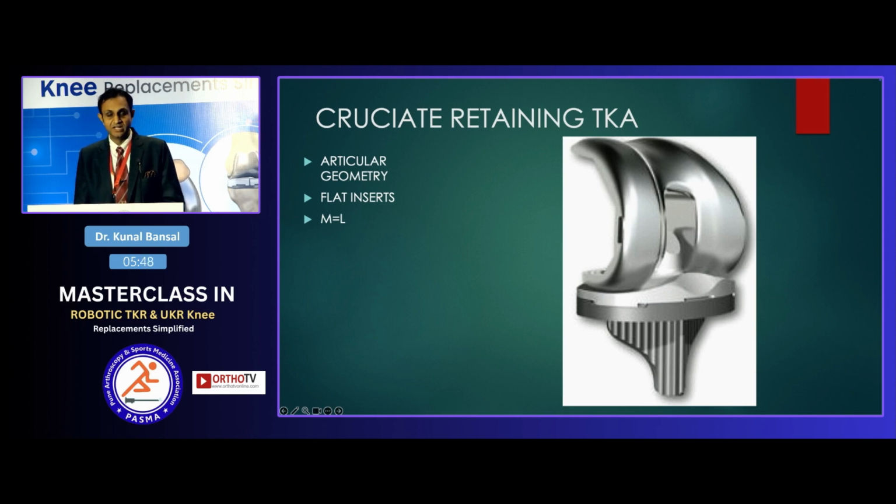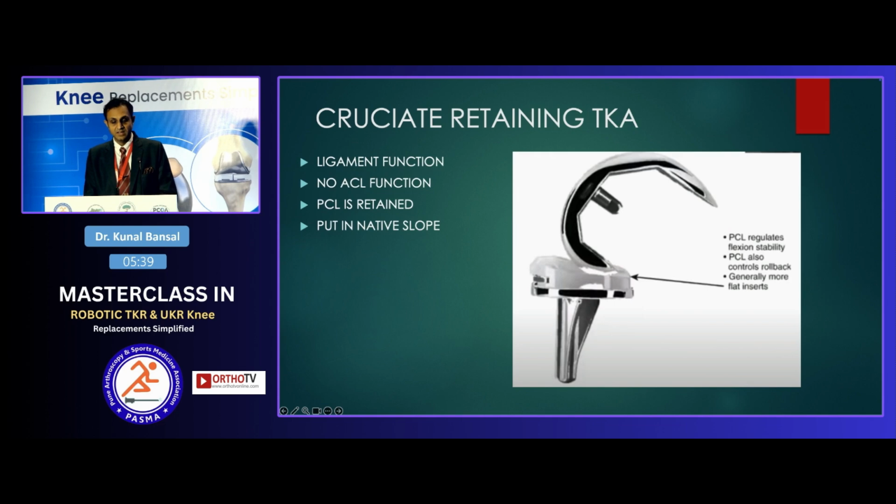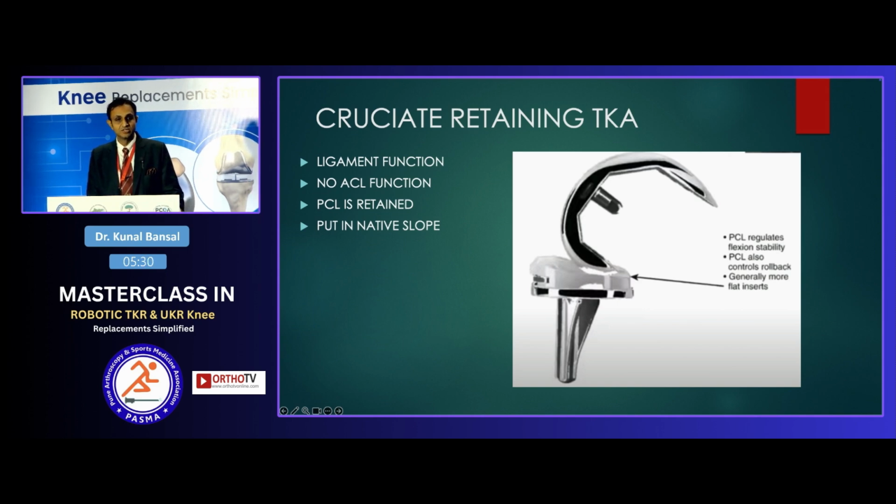So the cruciate retaining TKA. The articular geometry: the insert is a flat kind of insert where the medial and the lateral parts of the insert are identical. The ligament function, as all of us know, in the cruciate retaining TKA, we sacrifice the ACL and we attempt to retain, or we completely retain, the PCL. So there is absolutely no ACL function. The PCL is retained and we attempt to put it in a native slope. The PCL regulates the flexion stability and controls part of the rollback. And it's generally flat inserts.